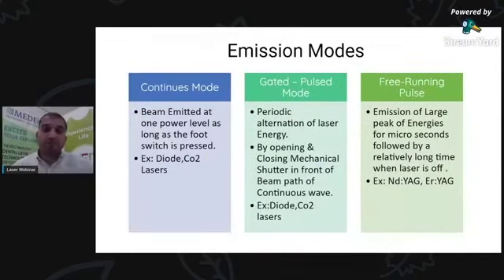The companies have helped us avoid carbonization by making a very good option in their devices, which is called emission modes. In any laser, as long as we are pressing the foot control, the laser is coming out from the handpiece. But in the emission modes, we have something called gated or pulsed mode.